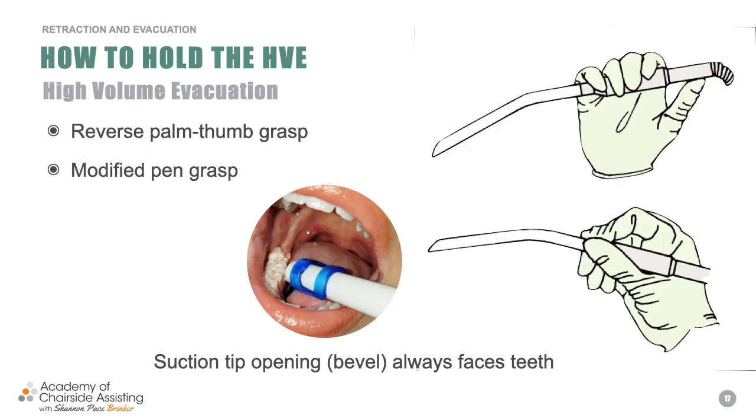And guess what? That makes the doctor aware, and it kind of makes the doctor look at us and roll their eyes, right? But again, we're human. But if you always aim that suction to the corner of the mouth, this won't happen, okay? So try not to do that, because if you go straight down the center, they're going to gag, okay? Anytime you're touching the center of that patient's tongue, that's what's going to happen. We also don't want to touch any instruments that belong to the dentist or the handpiece, because if you bump it, the doctor could hit the tooth and cut the tooth, or worse, cut the patient's tongue, all right?